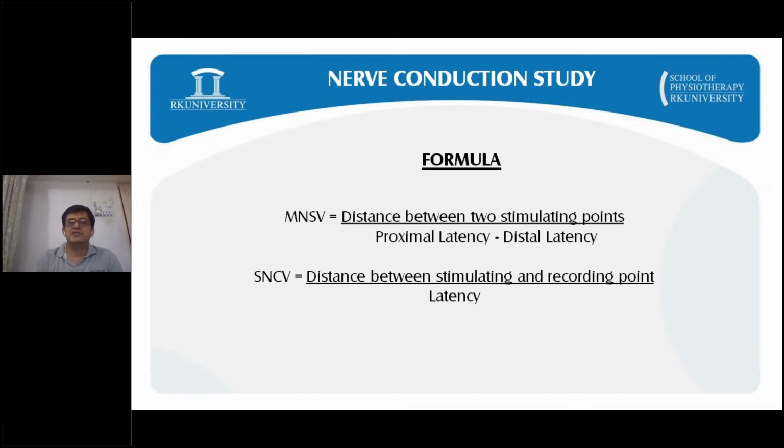Clear. And for SNCV, there is no neuromuscular junction, there is no muscle, so definitely it is the distance between stimulating and recording point divided by latency. Latency means what? It is time. Time taken by the impulse to travel from the stimulating to the recording point. That's it.